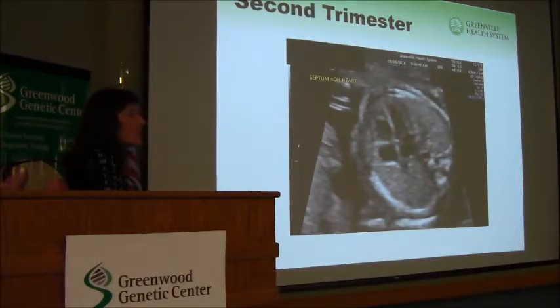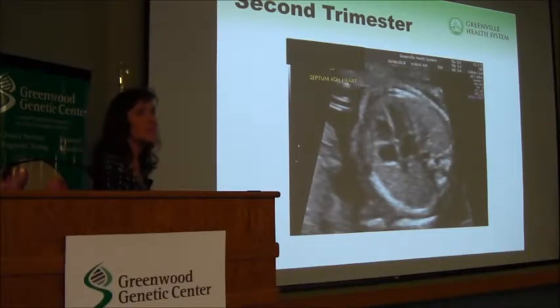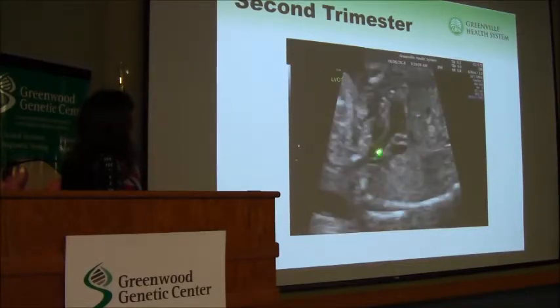Back up in the chest, we look at the heart on every baby in the mid-trimester because of the increased risk for heart defects, as Dr. Skinner alluded to, looking for this 4-chamber view where the atria and the ventricles are equal size, looking at the wall thickness, making sure there's no VSD or ASD. Color flow helps us a lot with this, but it's been published that in babies that have congenital heart defects, 90% of them will have some abnormality that can be identified just on this simple 4-chamber view, so this is an exceedingly important view to get. We can see the outflow tracts, the right ventricular outflow tract here, the left ventricular outflow here with the integrity of the septum.